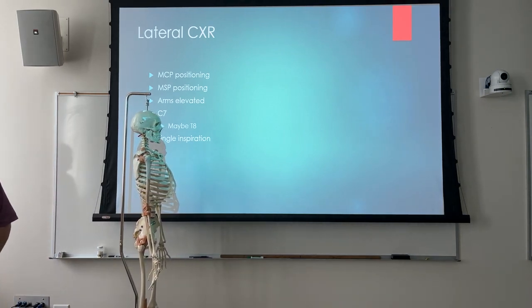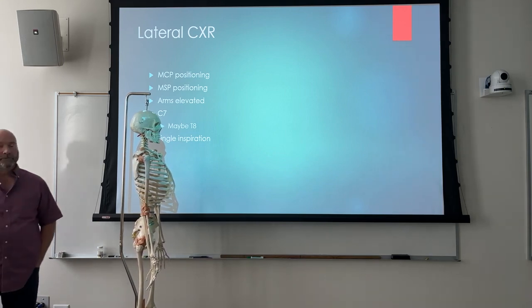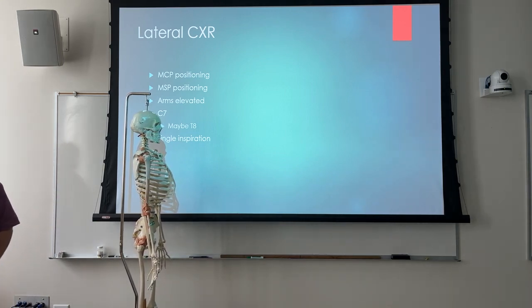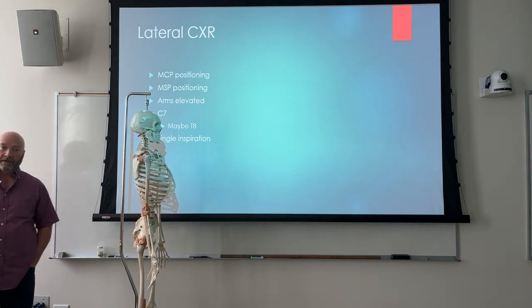I'm not saying that I either agree or disagree with not shooting as many laterals as what we used to. I will say that I went to a seminar as a continuing education thing, probably 10, 15 maybe years ago, where a radiologist was saying that they quit doing laterals altogether except for in special cases, and that was 15 years ago, and it's just now kind of filtered down to us, and it came to us, I guess, via COVID, really.